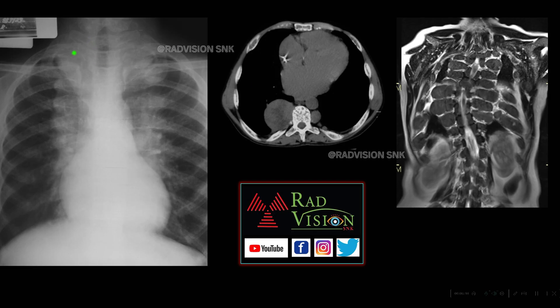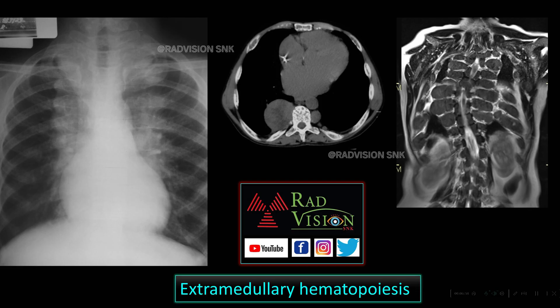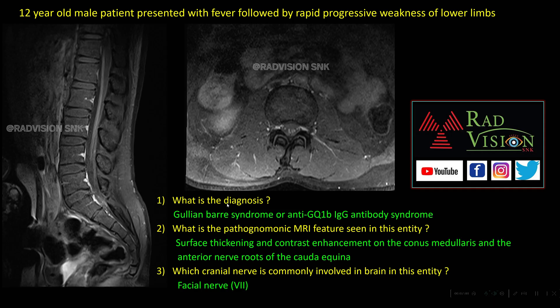Here you can see there are multiple paravertebral soft tissue density masses in the posterior mediastinum along with bony changes. On MRI, there are multiple symmetrical paravertebral soft tissue density masses typically involving the costovertebral junction — this is a classical case of extramedullary hematopoiesis.